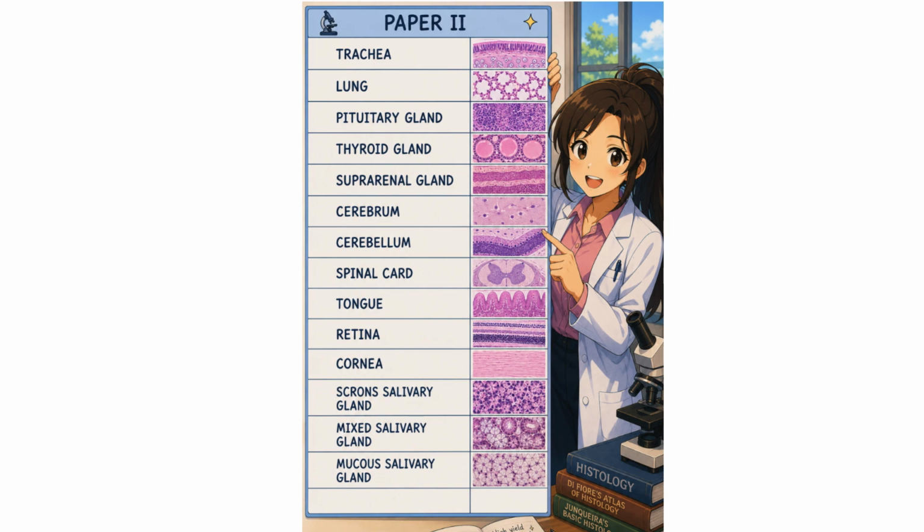Coming to thyroid gland, follicles filled with pink colloid is a key identification feature. Follicular cells lining each follicle are cuboidal. You have to know the different types at different stages, which are columnar and cuboidal. When it is active, it is more columnar. And parafollicular C cells are between the follicles, and they are paler staining.